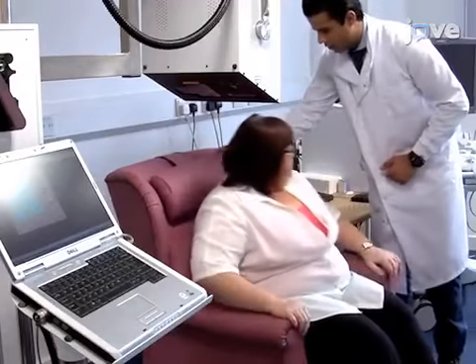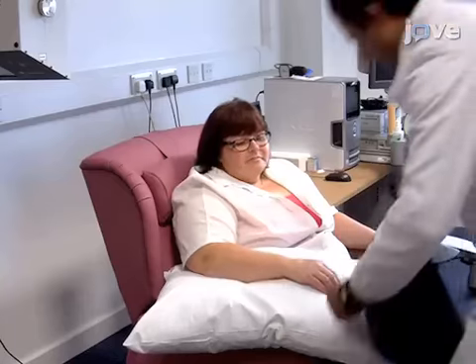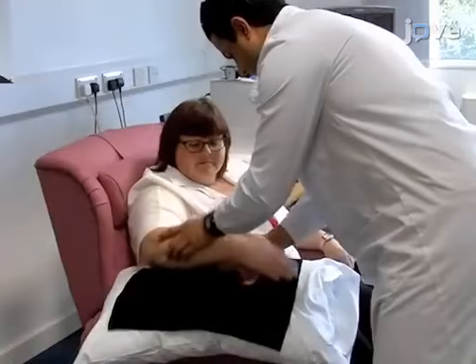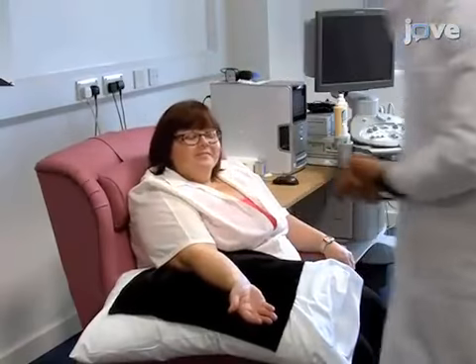Seat the participant slightly reclined and on a firm pillow with one elbow bent at 90 degrees and that forearm comfortably positioned on a black mat. Be sure to secure the forearm to the pillow so that it stays in place on the mat.